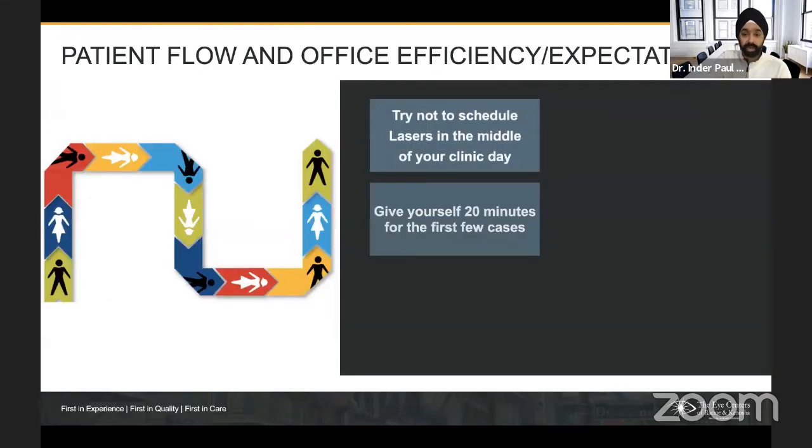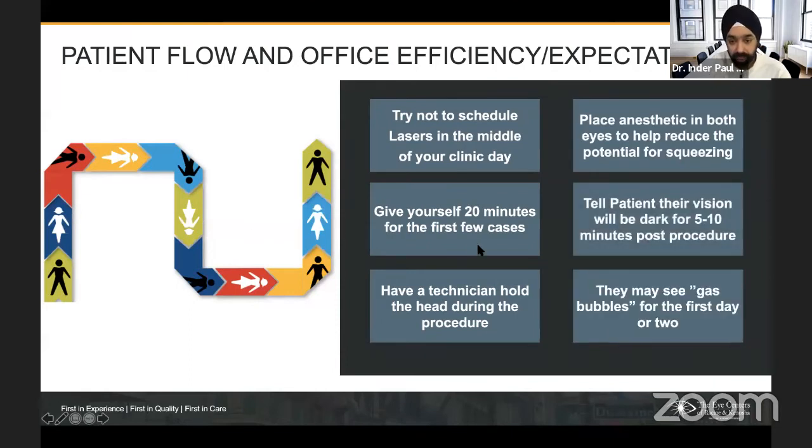I know there's a couple of questions before I finish here that I wanted to make sure. Can you use any other posterior lens aside from the Singh mid-vitreous lens? You can. I've used different lenses. Ocular Instruments makes vitreous lenses. You can use a Mainster or Rodenstock. It's just the view is not quite the same. I think the quality of the optics and what we've done with the convergence zone or the convergence of the optics allows you to see really, really clearly in the middle of the vitreous. But you can use any lens if you need to as well.